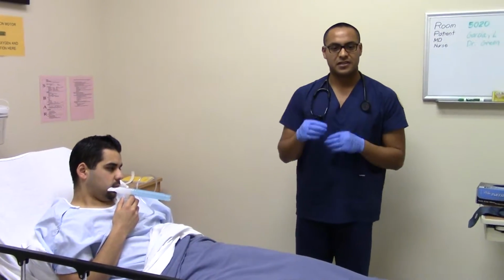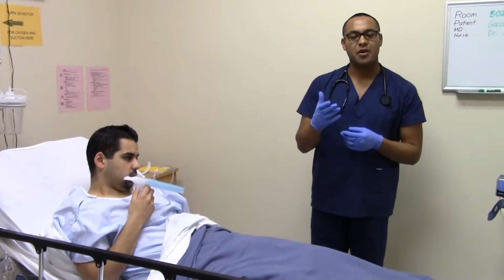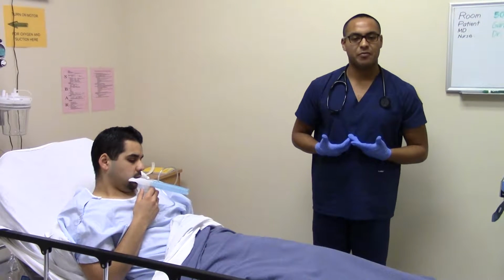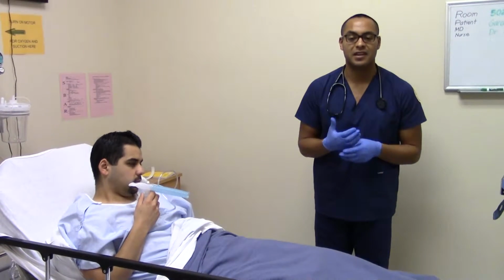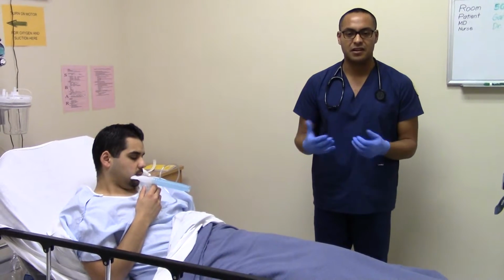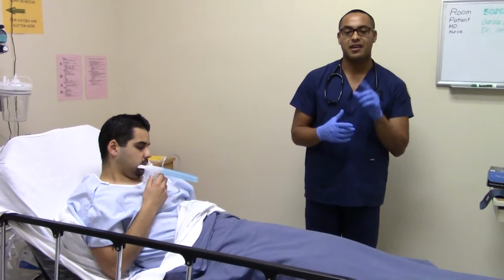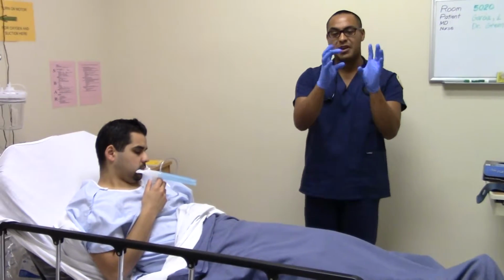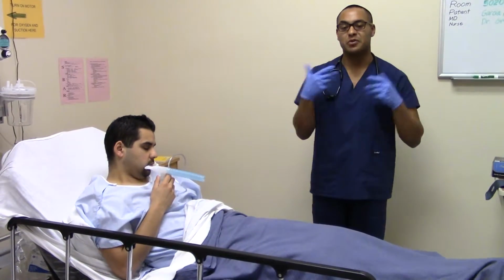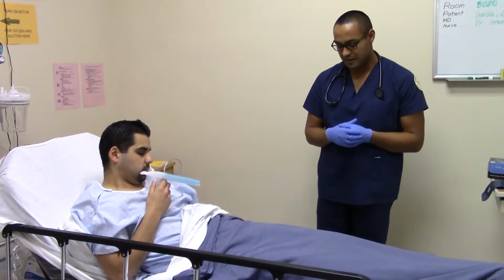This stuff is good because the size of the gas, it's small, so it's able to travel to the base of the lungs. Good deposition for the patient. Deep lung. Compared to a dry inhaler, which is bigger and more upper respiratory, this one is more intended for the bases.